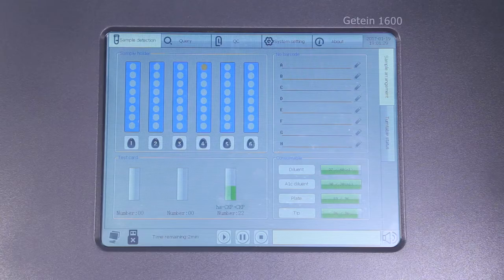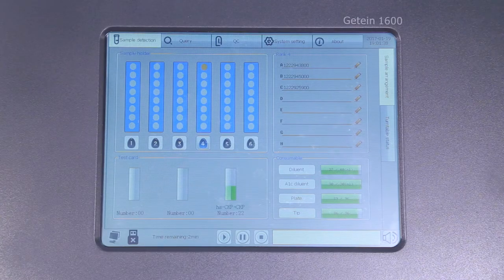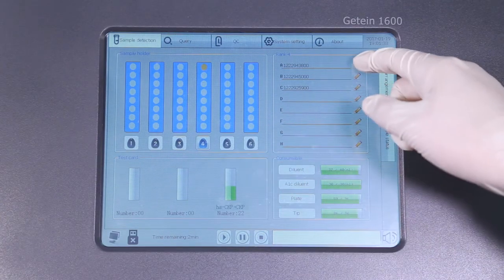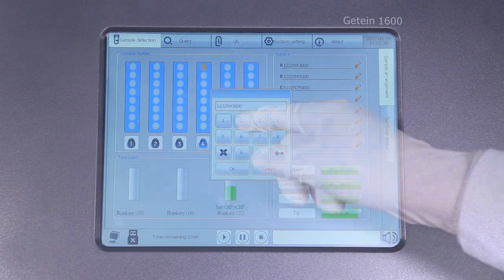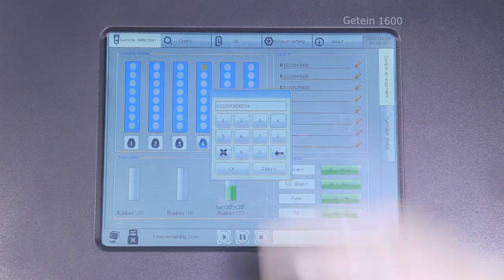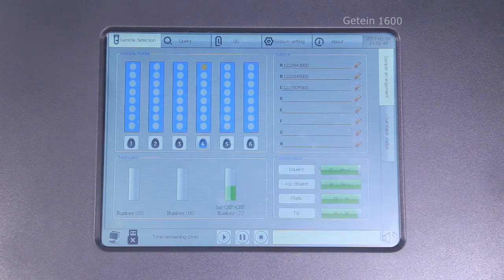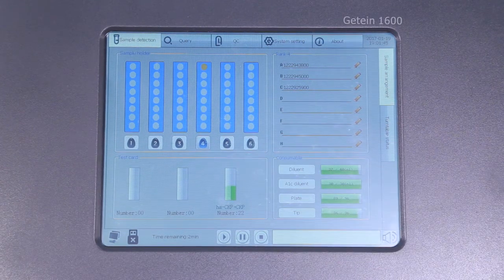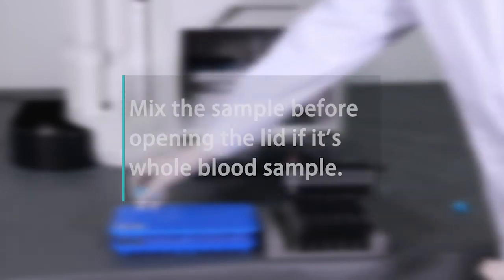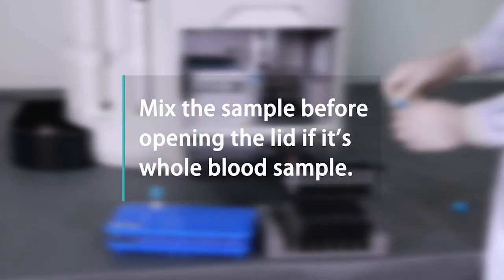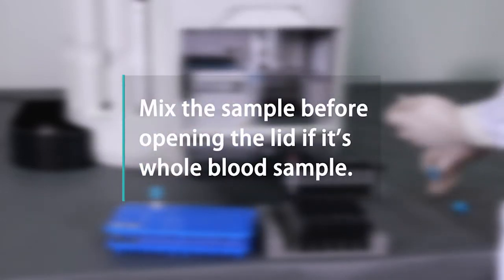The information will be displayed on the screen. Anything missed of samples can be edited by clicking the pen icon. Mix the sample before opening the lid if it's whole blood sample.